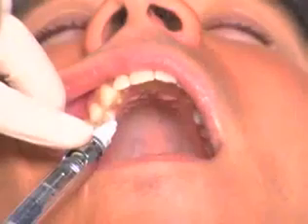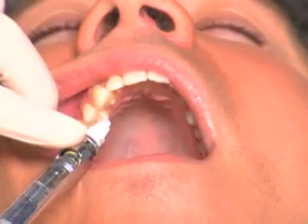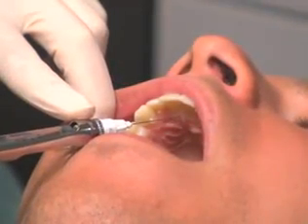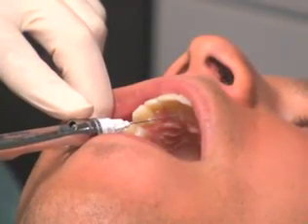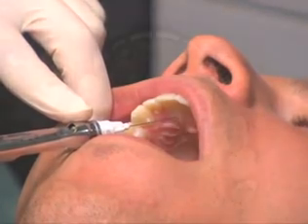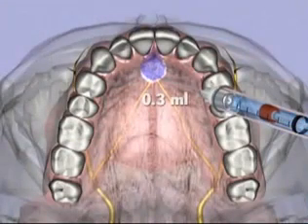The third injection is a traditional nasopalatine nerve block in which a needle is inserted into the soft tissues just lateral to the incisive papilla. The needle is advanced through soft tissue until bone is contacted, and following negative aspiration, 0.3 mL of local anesthetic is administered.